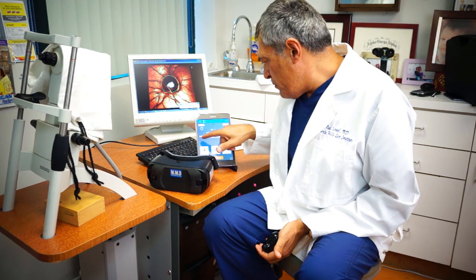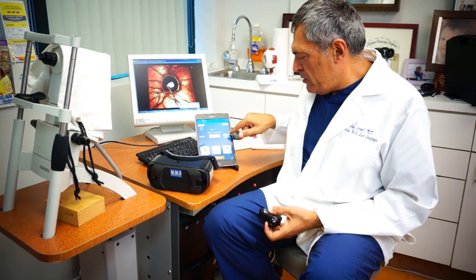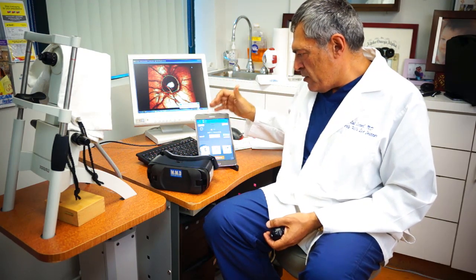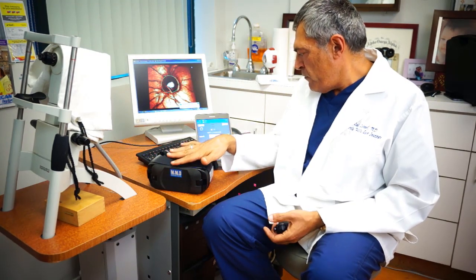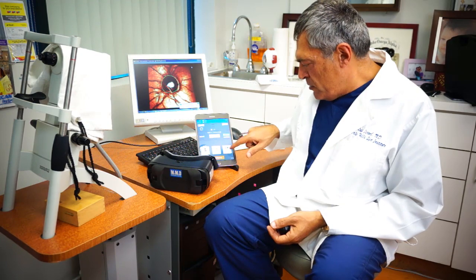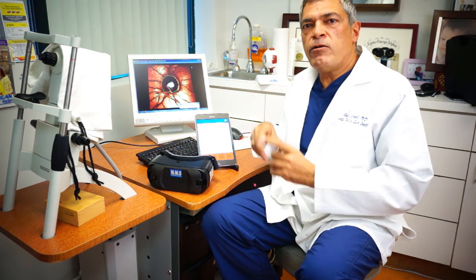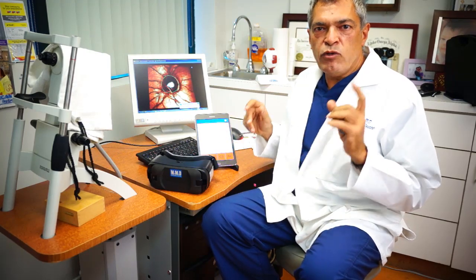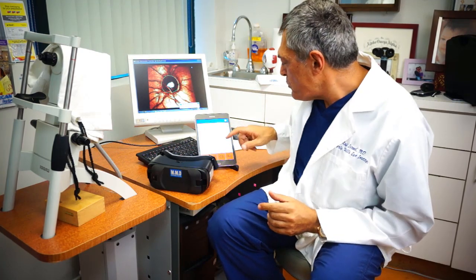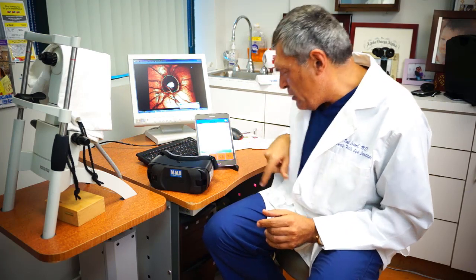At this point I will turn on my visual field analyzer. When the green light comes on, it means the controller is now connected to the visual field analyzer goggle. There is no need to occlude one eye or another, as the machine will automatically do this for the patient as they are doing the test.